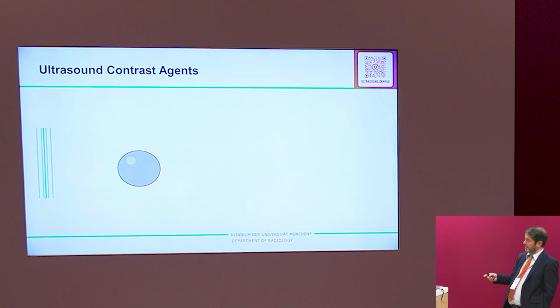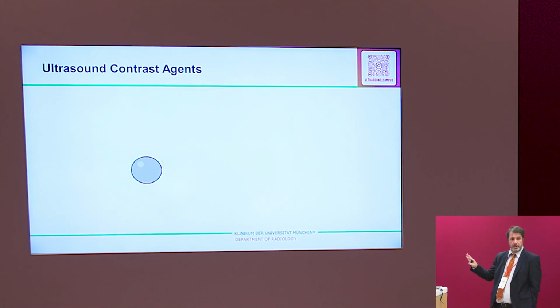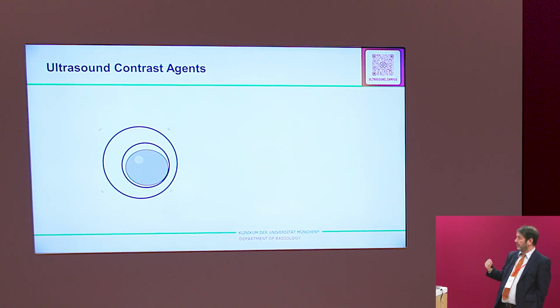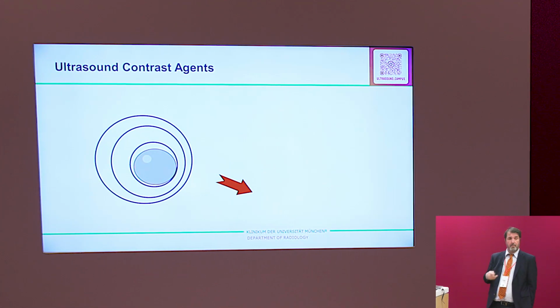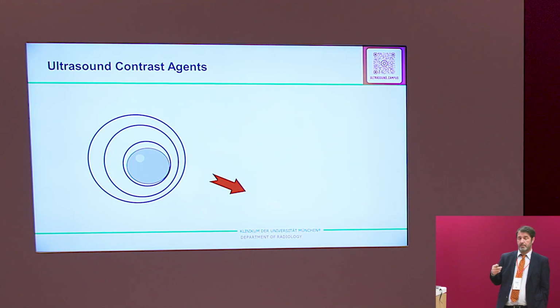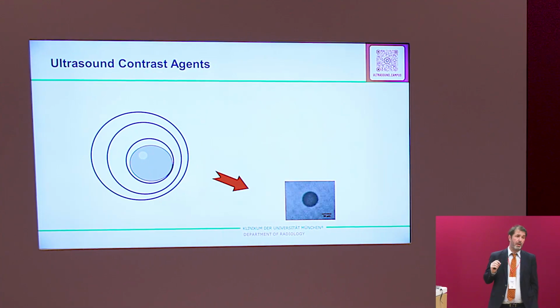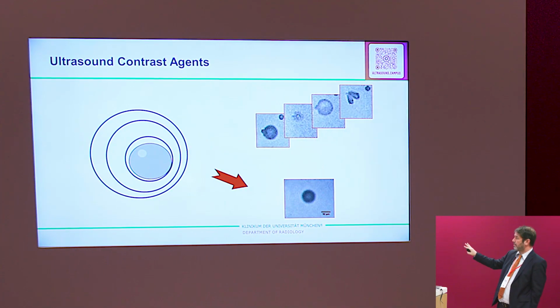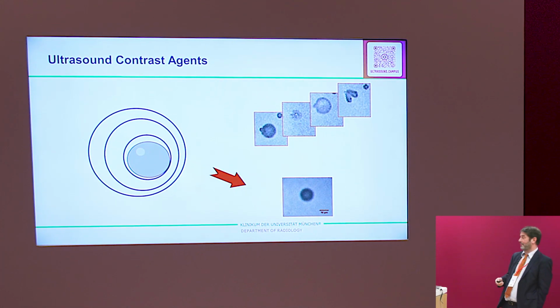So you see a single bubble, the sound wave of the probe compresses and decompresses the bubble, and the bubble is working like a backscatter. So we receive up to 30 dB more signal. But you need special software. If you don't have the software, you will burst it. If you have got the software, you see the oscillation of a single bubble. That's important. And if you try it without, you see this bubble will immediately burst. So you have no benefit, only cost. That's not good.